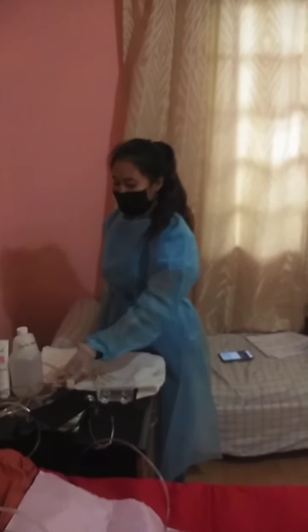So use your dominant hand to pick up the suction catheter without touching any non-sterile surface, and use your non-dominant hand to pick up the connecting tubing.